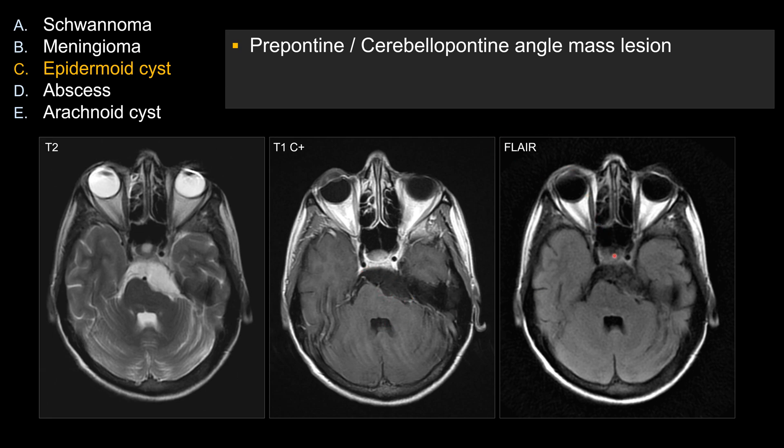However, on FLAIR, it does not suppress like CSF. So the internal fluid content is not purely cystic and is not a CSF-like substance within.